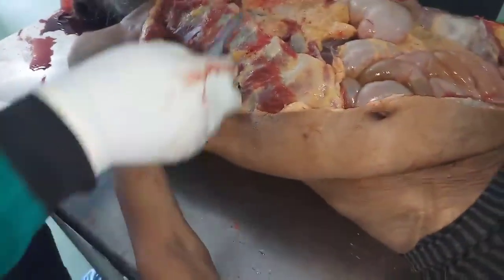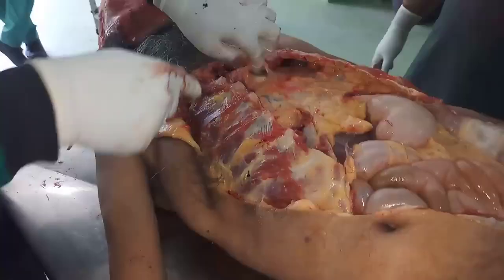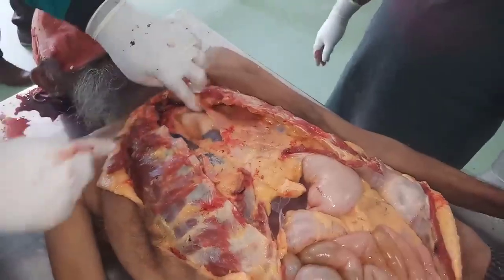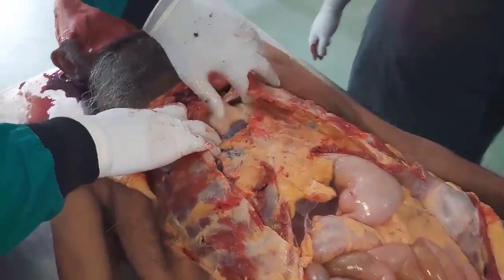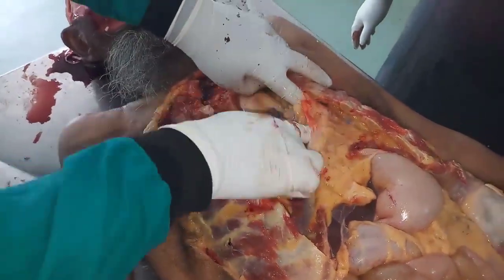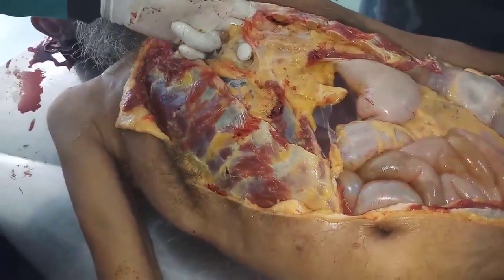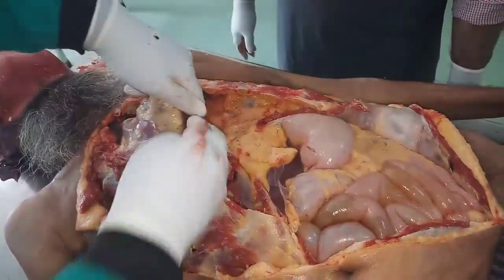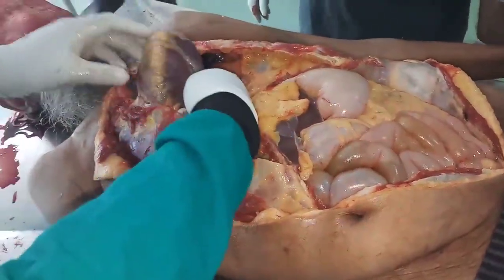We'll first open the pericardial cavity. This is pericardium. We'll open the pericardial cavity. We'll look for the heart. So there is very much fluid here. The amount of pericardial fluid is more than normal. Even in the brain we could see more fluid in this case. So there is some pathology. We'll study the pathology. The heart is enlarged.